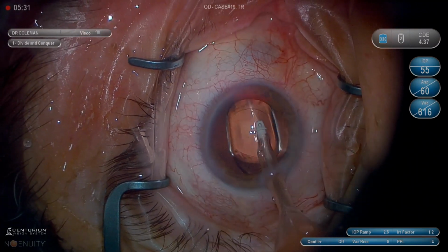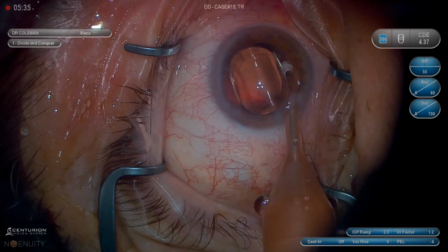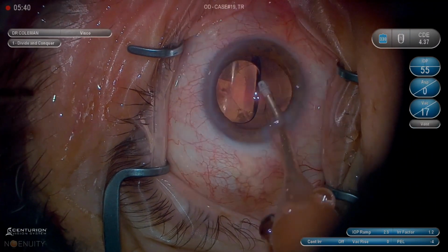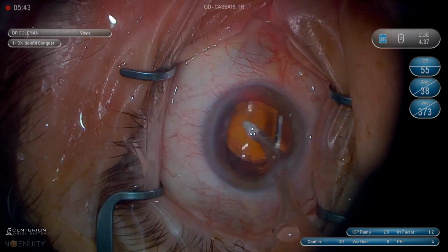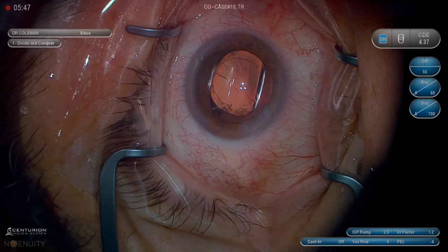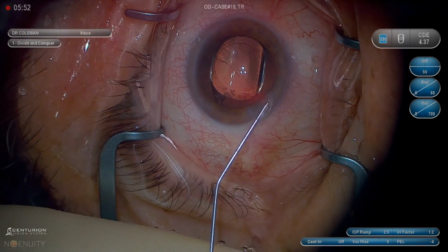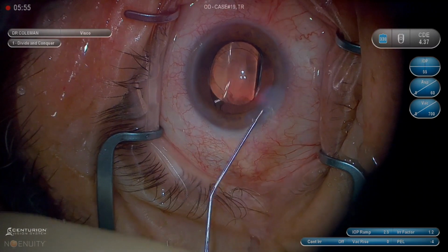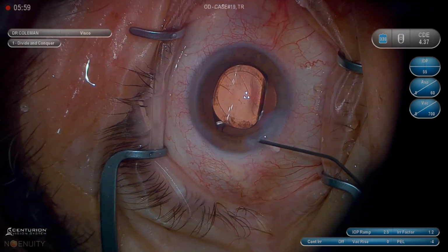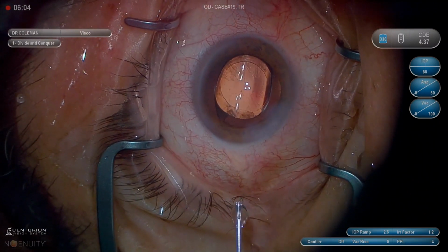You want to remember that if you have a fluid wave, if you are actively injecting, you cannot puncture the capsule, because there's a fluid wave propagating in front of the cannula tip where the puncture would have to occur. You'd have to do something very aggressive. So the time that you would puncture the capsule with the cannula is when you're not injecting and you're pointing posterior. So I always want to inject a little bit of viscoelastic in the anterior chamber and then fill the bag and then let the eye fill back up from that direction. And when it starts burping back out the main wound, I think you're pretty much done.